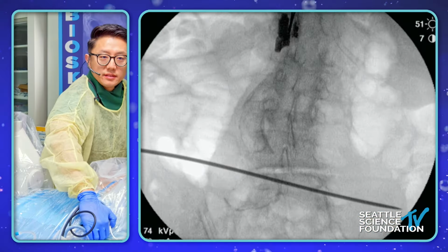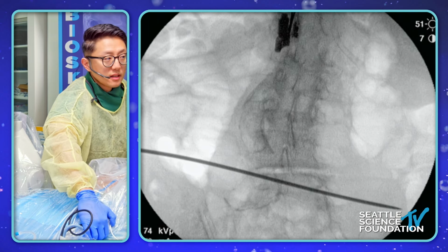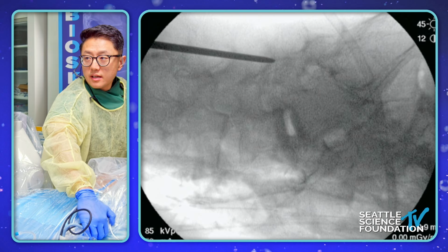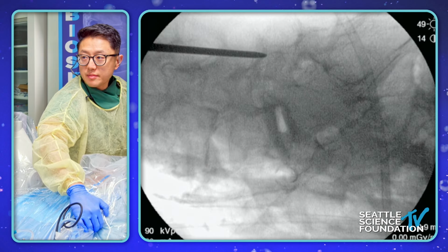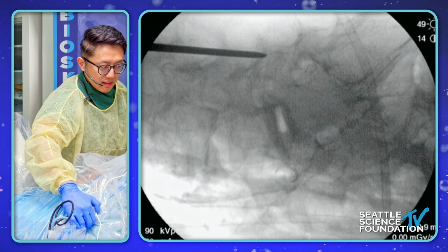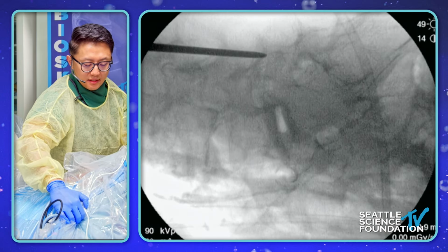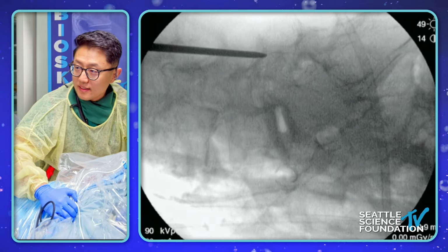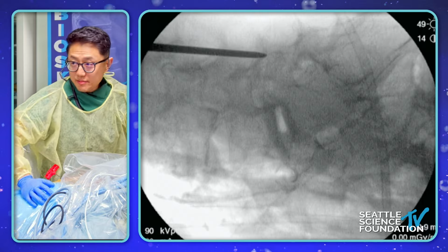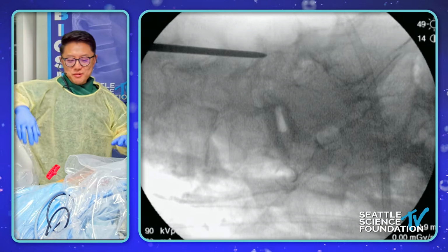Let's just take a shot there and let's see. Let's take a shot there. Can we take a shot? That's much better. One more shot there. Yeah, something like that. I think this is a really good example of how important the X-ray is. Do you guys see that? He was in the back of the facet joint. So getting this perfect AP X-ray almost threw him off, but thanks to our help. All right, that's awesome. You gave me a scoliotic level with a grade 2 slip. That's fantastic. Thank you. One more shot there.